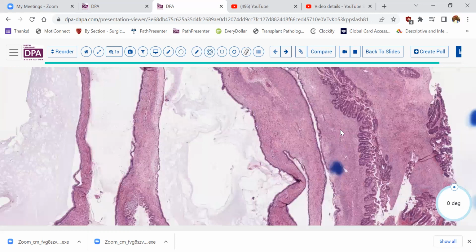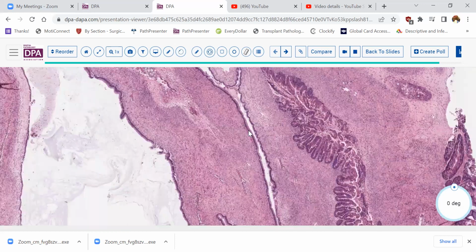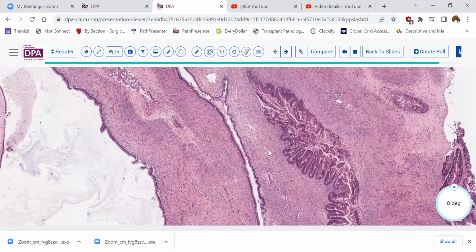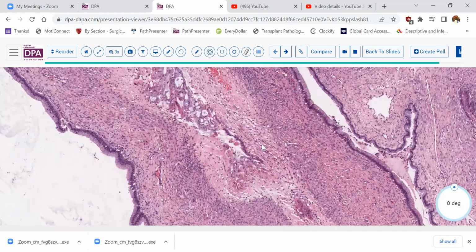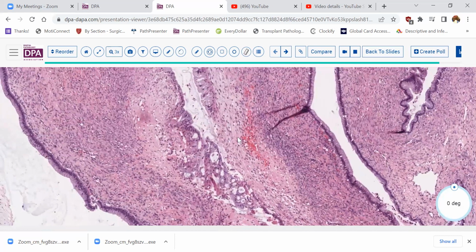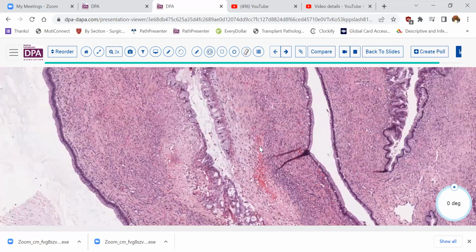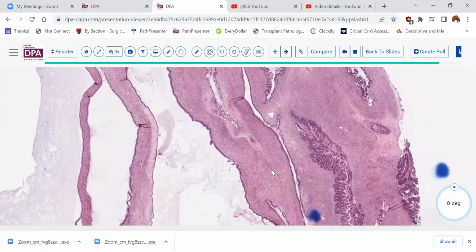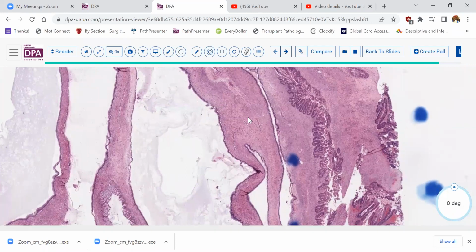Perhaps just looking here at the stroma, you can see that there's very little difference between the stroma around this clearly benign area and the stroma around this intraepithelial carcinomatous area. So that's helpful in recognizing that the stroma is not responding in quite the same way. Here, there's a little bit of response around this area, but we don't have quite the same level of atypia here. So it's sometimes a little bit difficult to definitively state whether or not you have early stromal invasion.